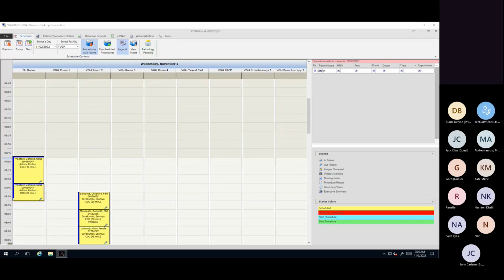I'm the support analyst for EndoPRO for VCH, PHSA, and PHC. And today we've got Munir from Provation, who is the vendor, who's going to do some training with us today on DocuScribe. So, Munir, I'll turn it over to you, and feel free to jump in with questions if you have any.